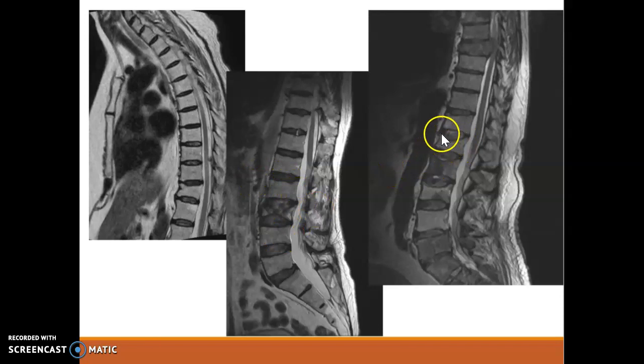Looking over here, you can see there's some extrusion of the disc itself. Is that a fracture of the vertebra? Is it that there's some degree of tumour that's sat within the spine itself? So again, you don't need to make that decision. This one here doesn't look quite normal either. You don't need to make that decision or that call. It's just being able to recognise it.